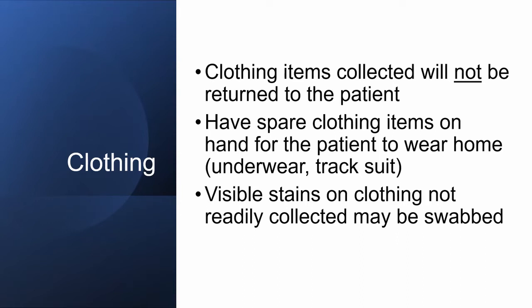It's a good idea to have spare clothing items on hand for the patient to wear home. Visible stains on clothing not readily collected may be swabbed. An example where this may be considered may be a winter jacket.